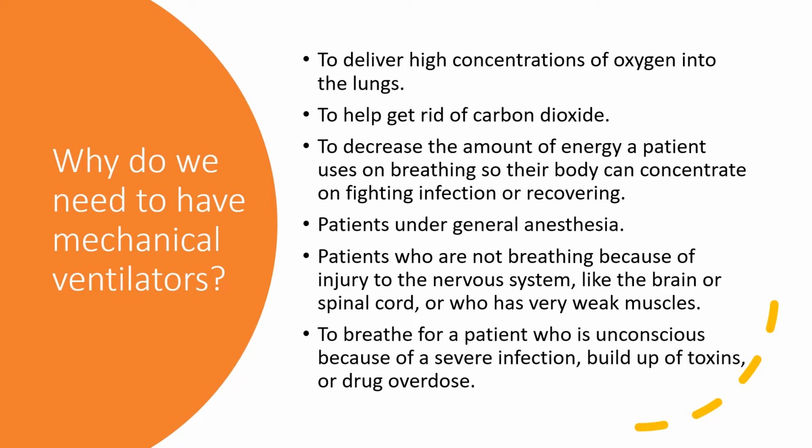Suppose someone has an exacerbation of COPD and they retain too much carbon dioxide, or suppose someone has a drug overdose and they stop breathing and retain too much CO2. Mechanical ventilators can actually remove the CO2 from the lungs by increasing the minute ventilation.